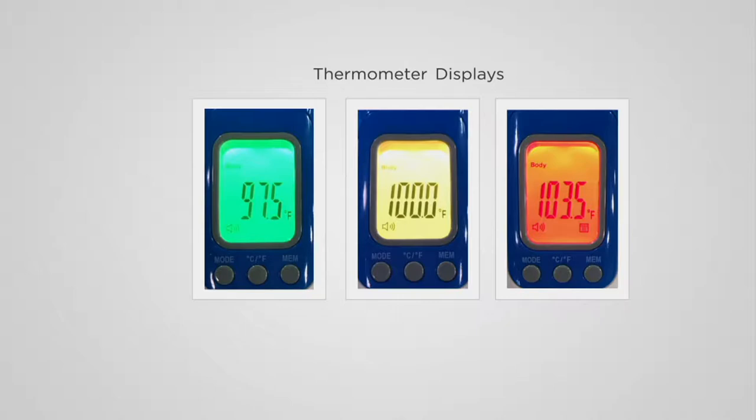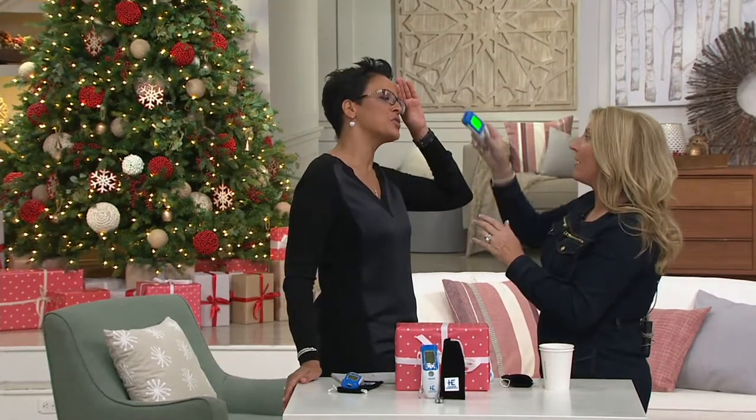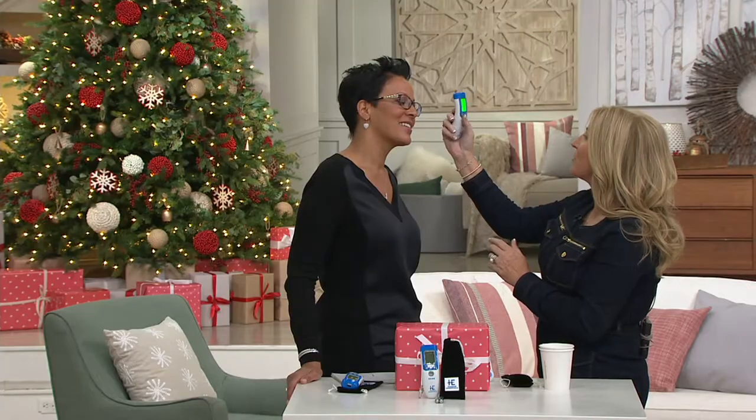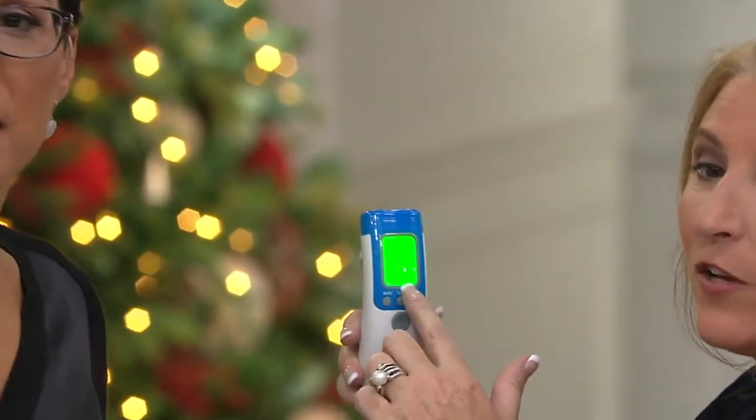It shows me my temperature when I need it, shows me without touching me. You want to take my temperature right now? Yes! Oh my gosh, that's so important because I feel so sick. Here we go, let's see how you're doing. And you are at 89 degrees — so that's surface temperature. So we're going to do body temperature. 97.5 — so you're nice and healthy. It backlit green.